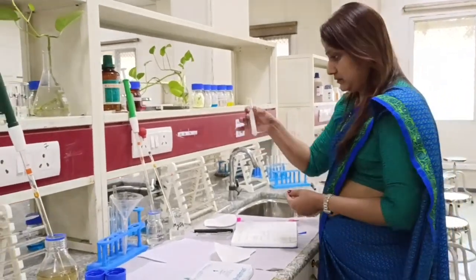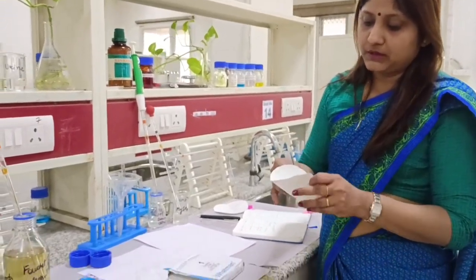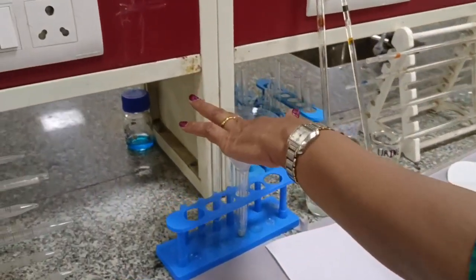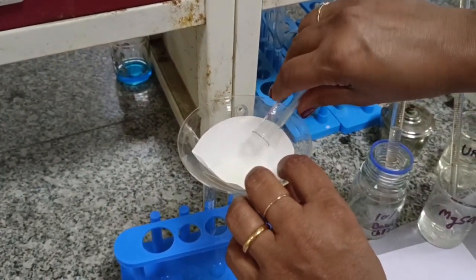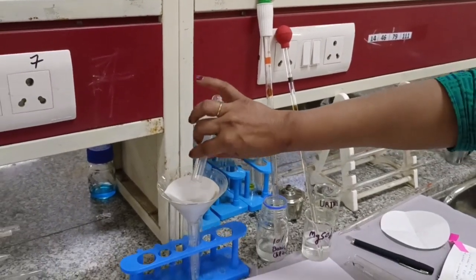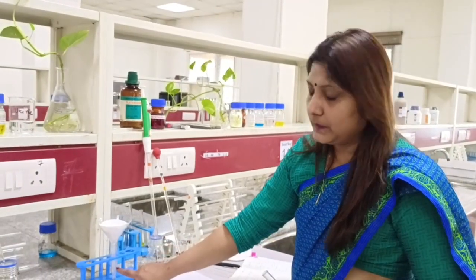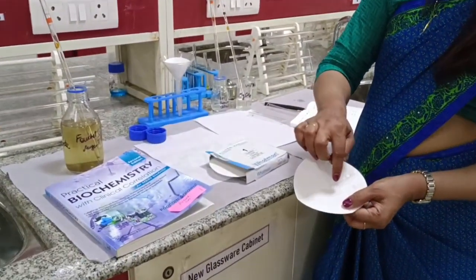Now this urine sample is to be filtered. A Whatman number 1 filter paper is used. It is folded in a specific fashion, then opened and placed in a funnel. This test is also known as the filter paper test because, unlike other biochemistry practicals, we use filter paper here. Pour the whole urine solution onto the filter paper and wait 7–10 minutes for it to filter. The filtrate collected in the tube is discarded; what we keep is the filter paper which now retains the barium sulfate precipitate.